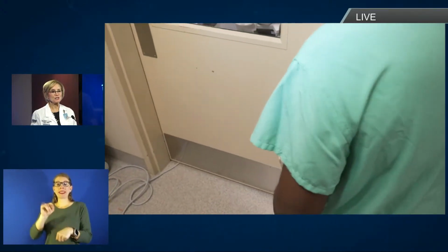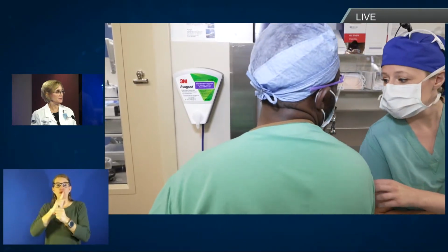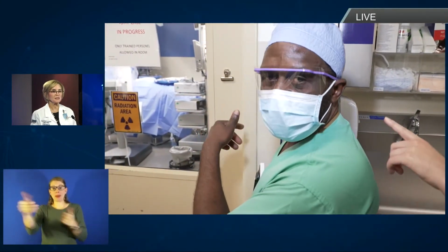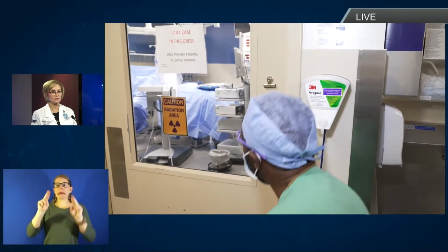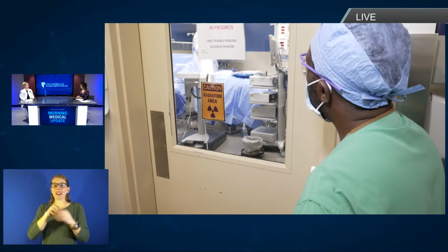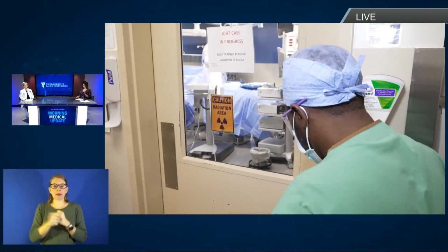And what is that right there that he's holding? That's a Geiger counter. So Dr. Neba is checking the surrounding area to make sure that we are looking at if there's dose leak outside of the room and where it is, so that we keep everyone outside safe and away from the radiation source. And you can see he's got some radiation stickers on the window to not enter the room during the procedure. So everyone's out of the room except the anesthesiologist, who is behind a lead shield. So the anesthesiologist is kept very, very safe, correct? Yes, very safe.